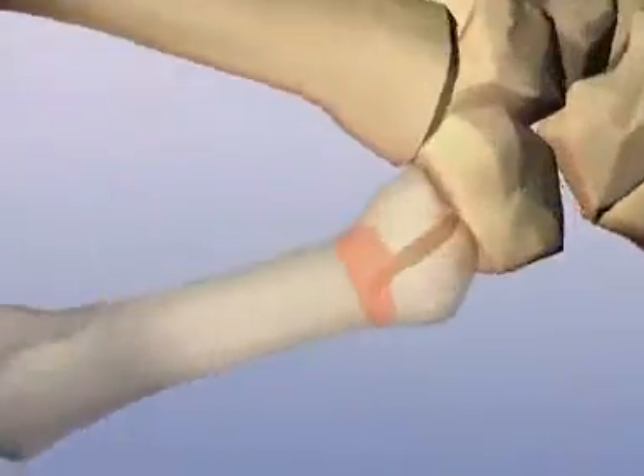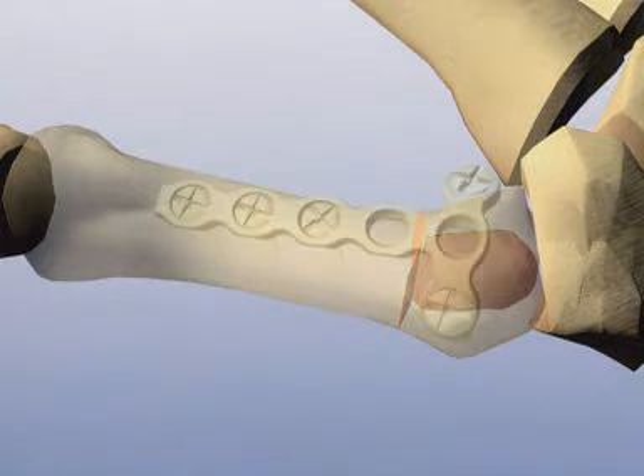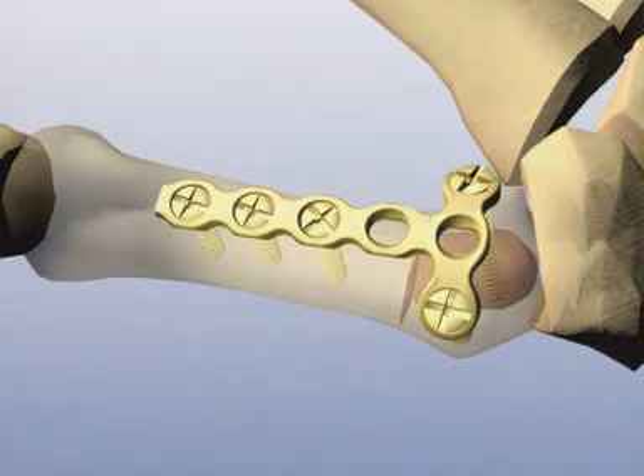An intra-articular T-shaped fracture of the base of the thumb metacarpal, a so-called Rolando fracture, is to be stabilized with a 2.0 T-adaption plate with three holes in the transverse arm.